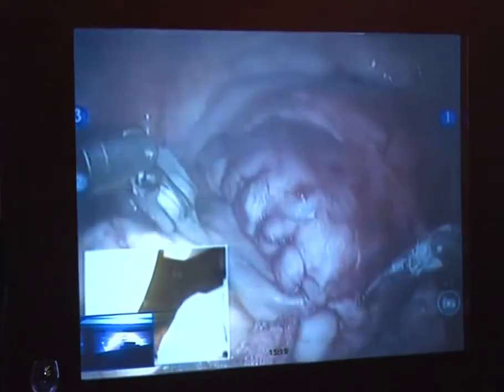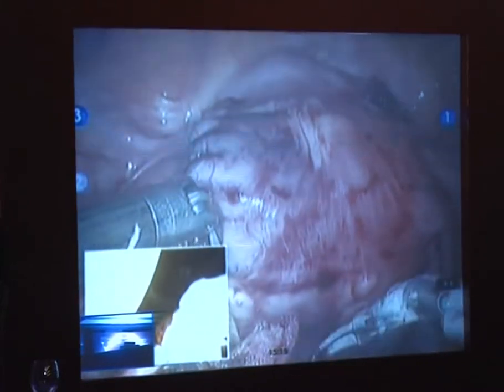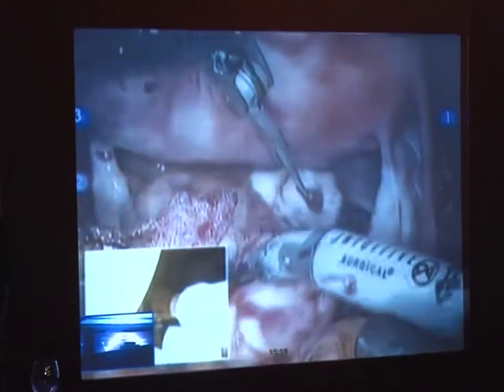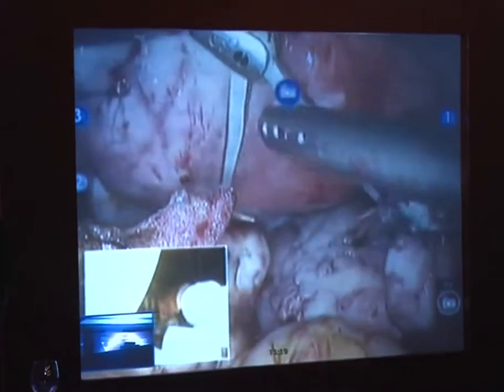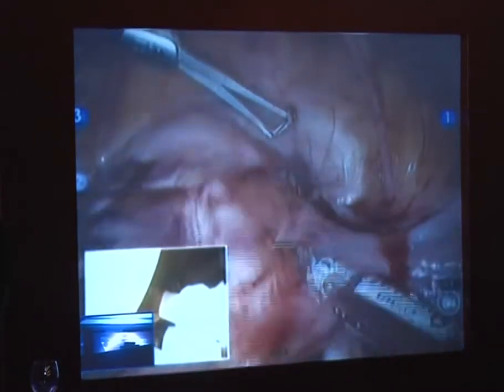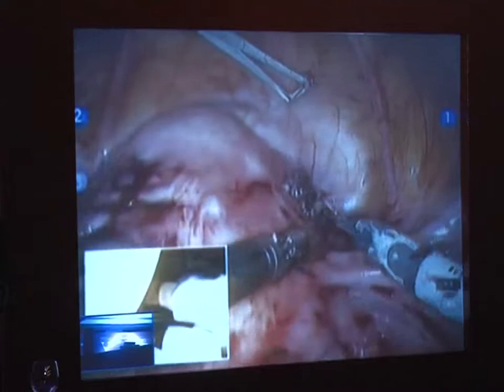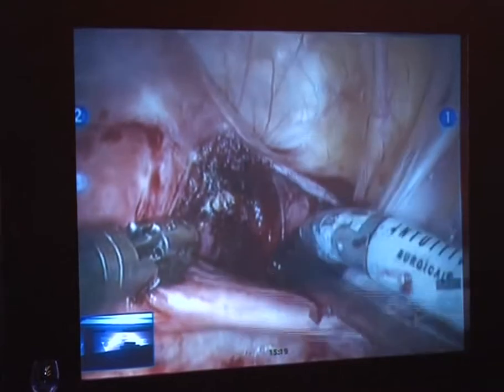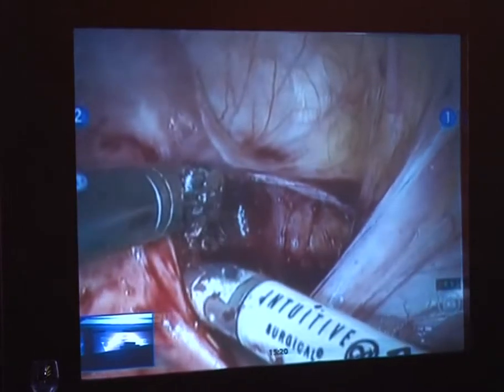Come back out. The nice thing is we didn't make a defect in the posterior broad ligament. Now, if we had a hole in here, then we'd have to repair that because there's a risk of herniation of bowel. But with this, you can make the argument, do we reclose this with some suture, or do we just let it be and let it reperitonealize? Because once we get the manipulator out of here, that's just going to sit like that, right? This way you don't get a hematoma either if you get a little bit of oozing. Let's go ahead and irrigate in here. Irrigation, please. Kept the round ligament intact, which is always good.